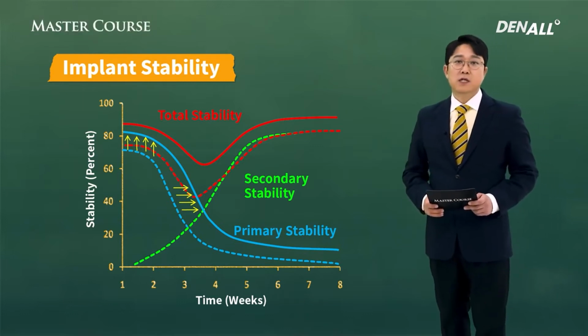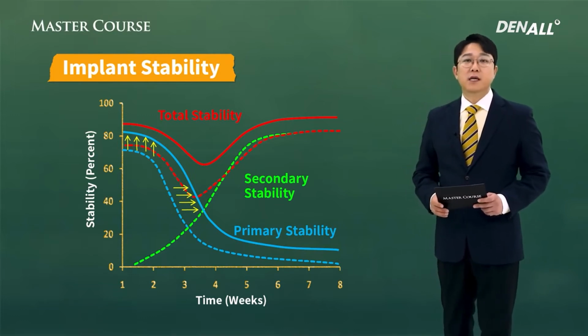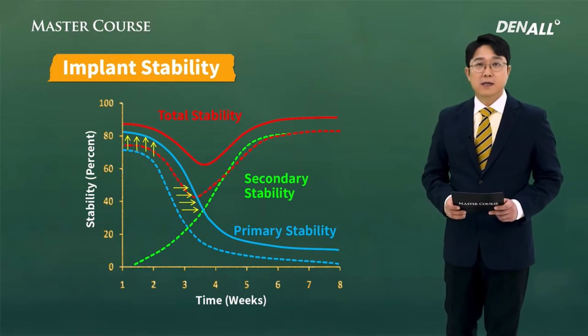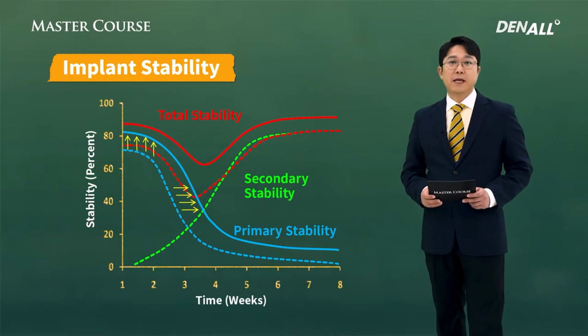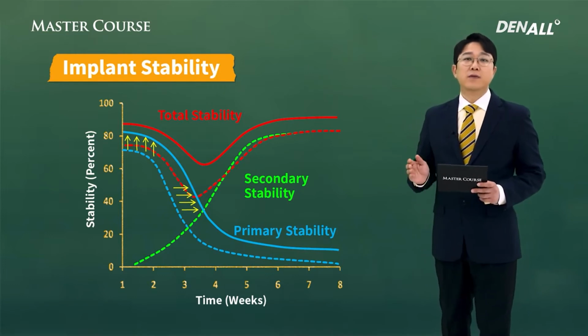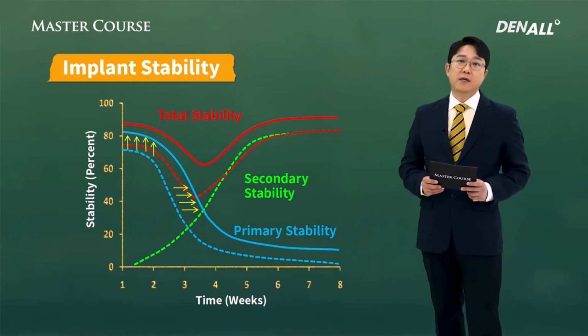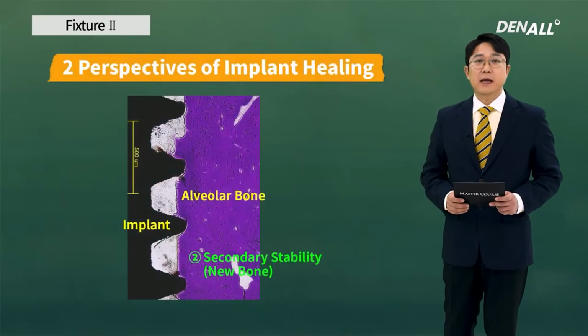Such heightened primary stability contributed to the loading time. Immediate loading, immediate functioning has been achieved with this increased primary stability. We are doing a lot of one-day implants, so this has contributed to enabling the one-day implant.